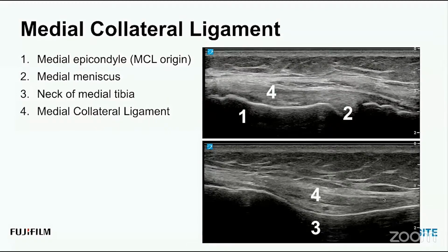We're going to keep going way out of the frame here. It goes into a very loose, leafy, very broad insertion across the tibial, almost to the tibial tuberosity distally. It's a very, very long structure that a lot of anatomy models and diagrams really don't give justice for how long the MCL actually goes.